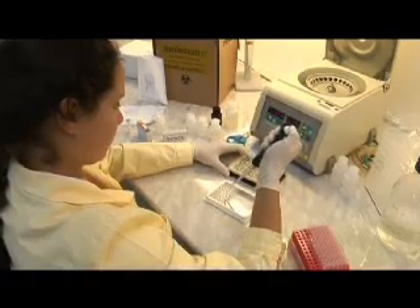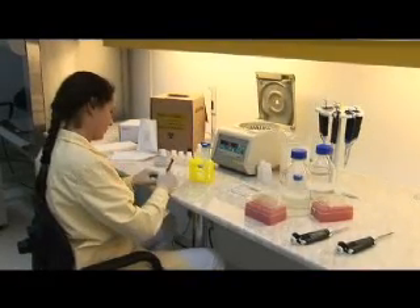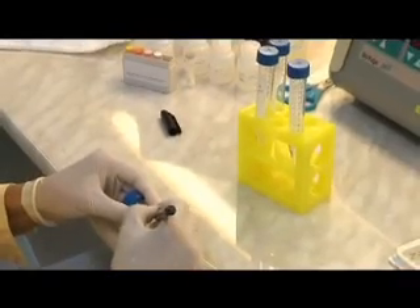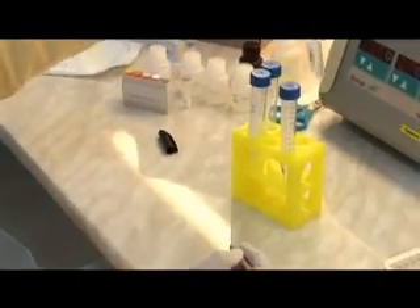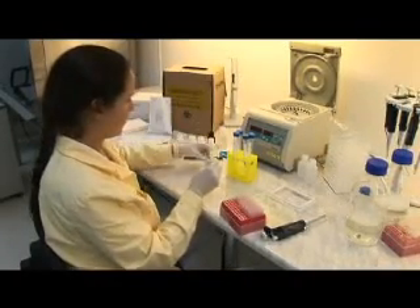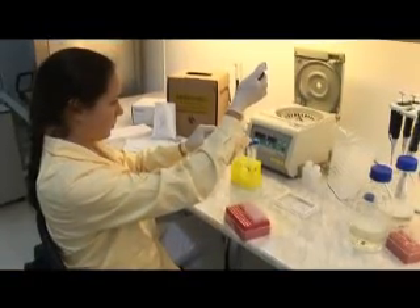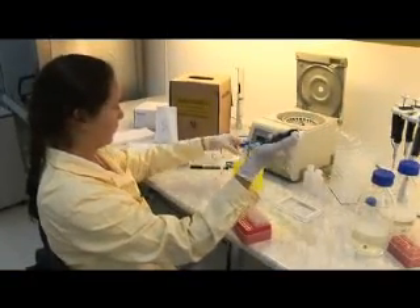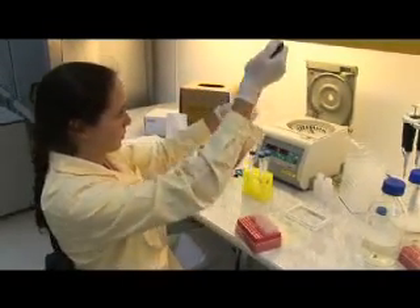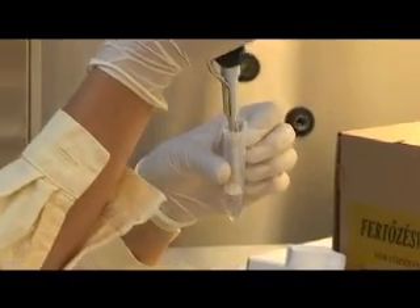Also, PCR negative and positive controls are added to the plate. During the incubation process, prepare the working probe cocktail reagents in four separate tubes: for high risk, use HPV high risk probe mix; for low risk, use HPV low risk probe mix; for internal control, use HPV IC probe; and for general probe, use HPV general probe mix.